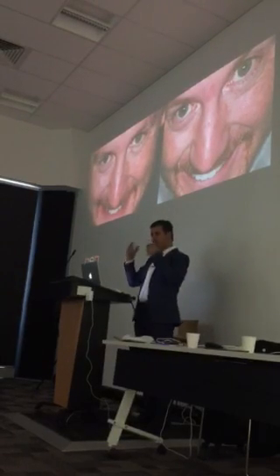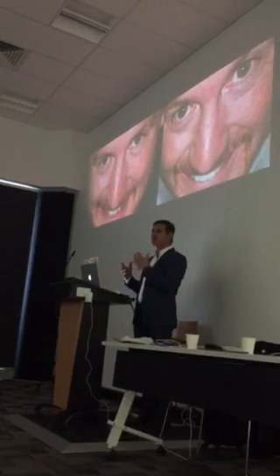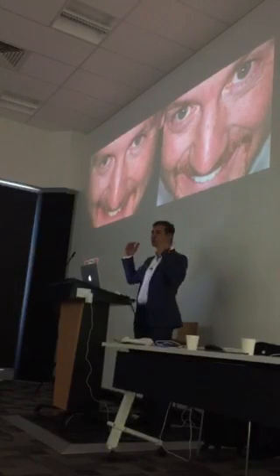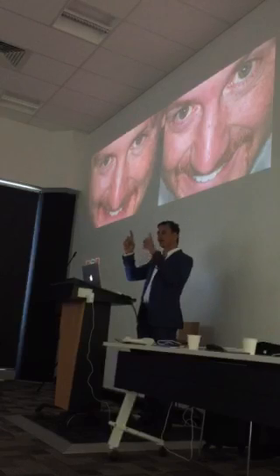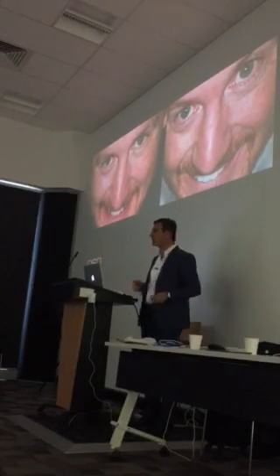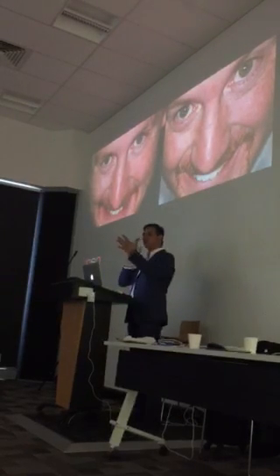And once you do your mock-up, these are perfect for additive cases, but then you get some subtractive points and you do mark them out. And Angela will show a couple of these cases, where often the premolars are hanging or some of the canines. You just get a little marker. When you take the photo, that's why you never give them the mirror to have a look at it. You mark out those and you see the proportion on the photo.